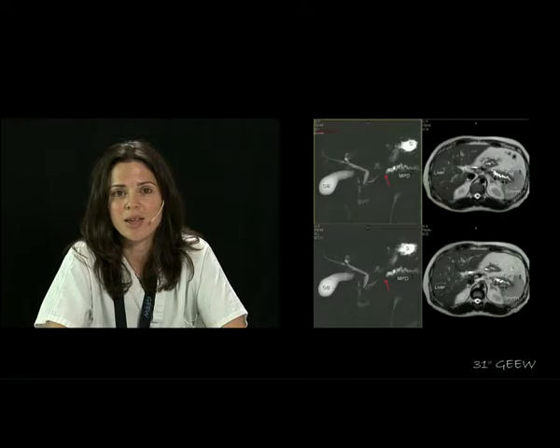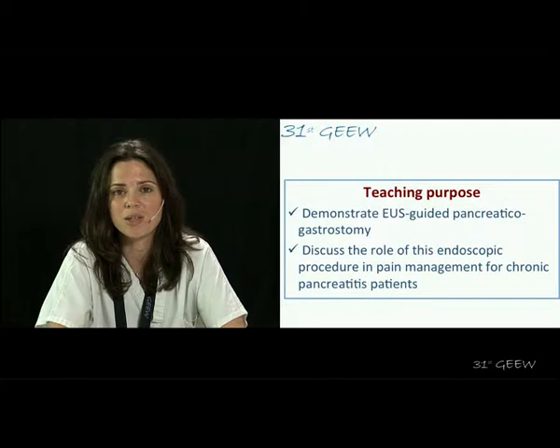We can see the MRCP, which shows the disconnected duct syndrome with a dilation of the corporal-caudal segment, and he also has splenic vein thrombosis. So he's scheduled today for EUS-guided pancreatico-gastrostomy, and we can join Marc Giovannini for the procedure.